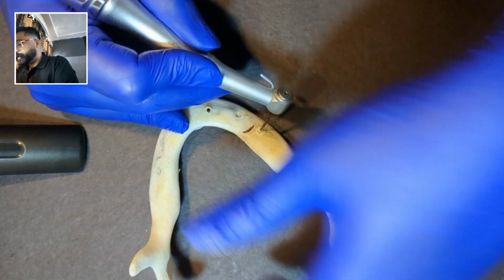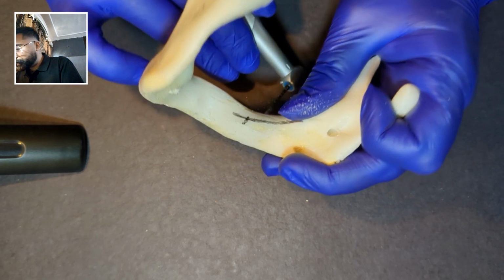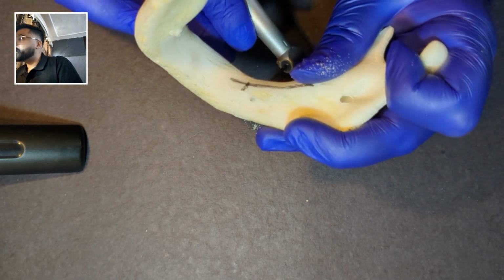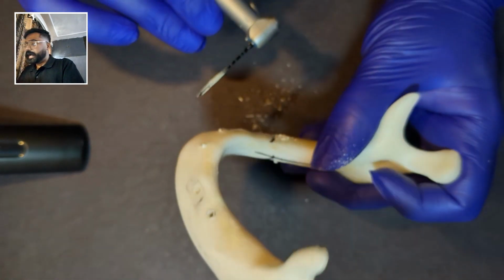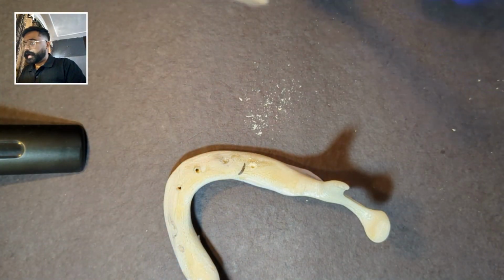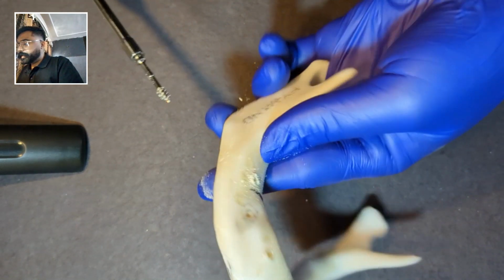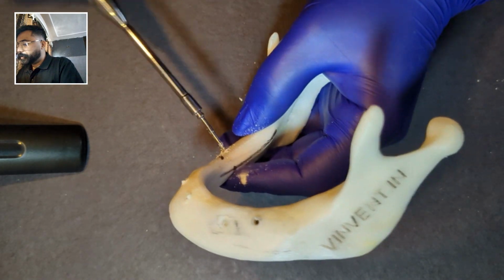Now I am able to feel the tip of the drill, right? Everyone can see this. I have just perforated and I don't have to go beyond that. Once I feel the tip of the drill, I will take my implant and start tightening the implant in the osteotomy site.